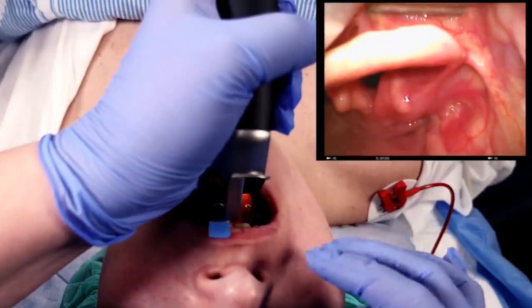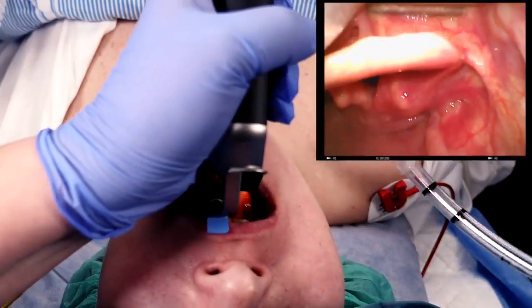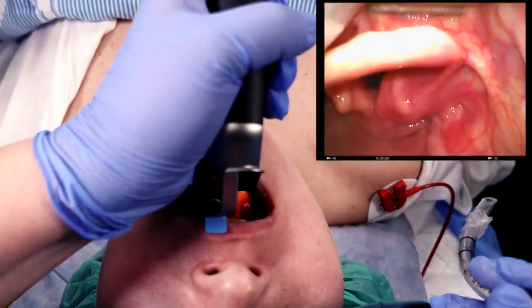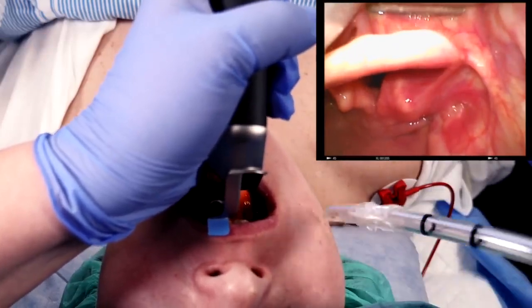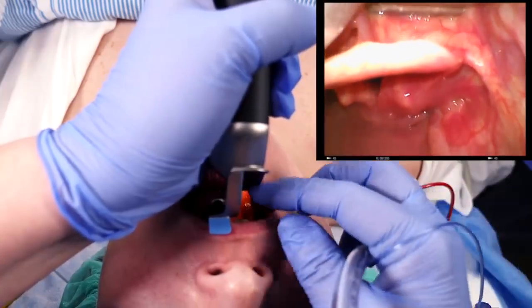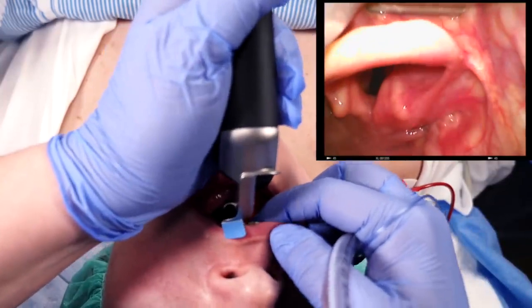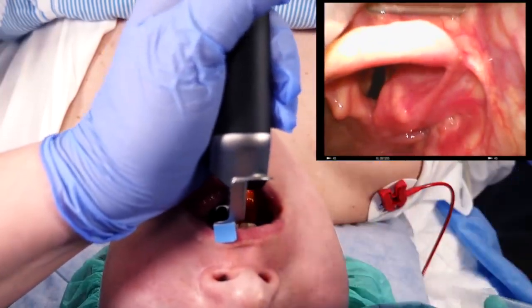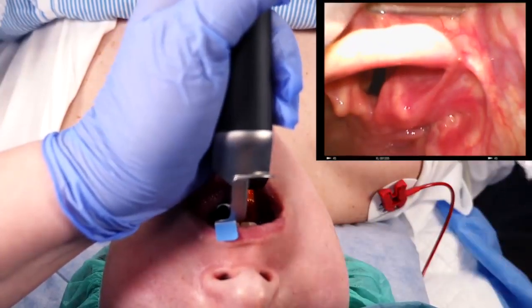Make sure you don't pinch the lips and do not exert any pressure on the front incisors. By now you hopefully have a clear view of the opening of the trachea — a dark slit between the pale vocal cords.